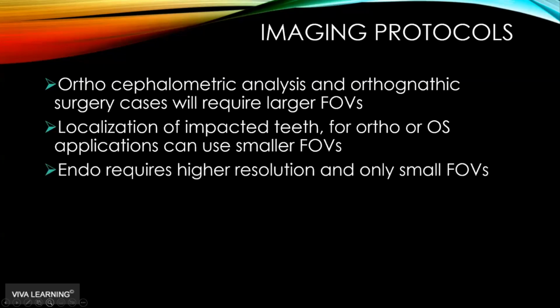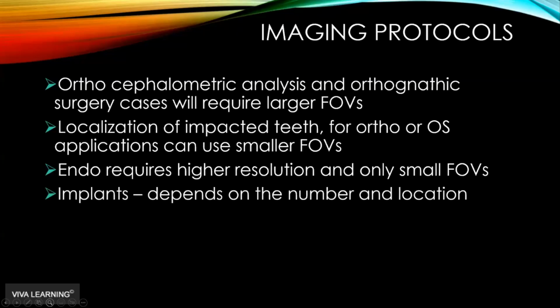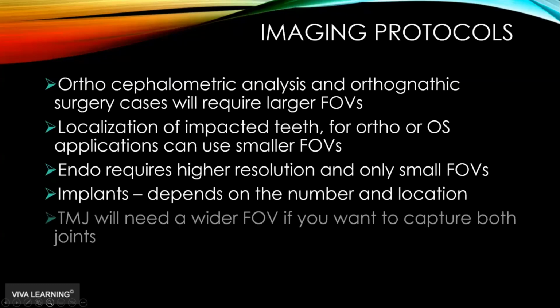Endo, as we've mentioned already, needs very high resolution and small fields of view. And implants, it depends on the number and the location. Are we just doing the mandible or the maxilla? Mandible, or are we doing both the maxilla and the mandible?